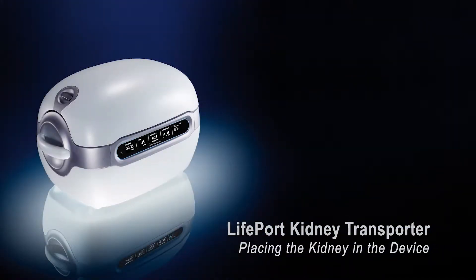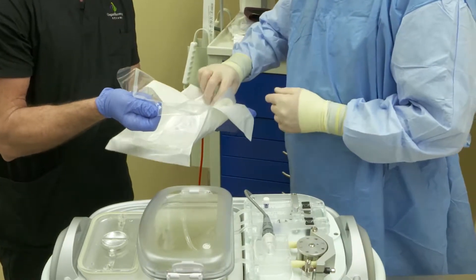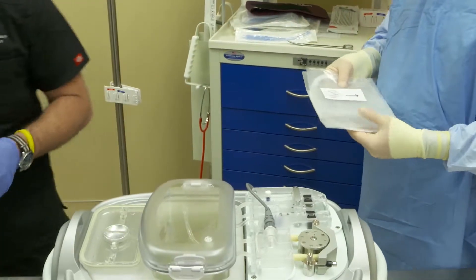Placing the kidney in the Lifeport Kidney Transporter. Now that your kidney is in the kidney cradle, you are ready to place it in the Lifeport Kidney Transporter.